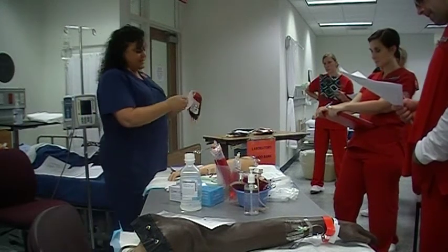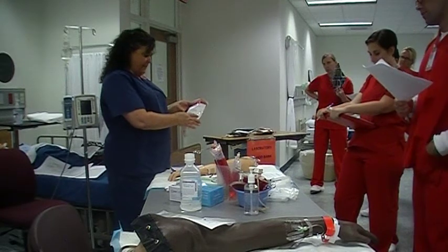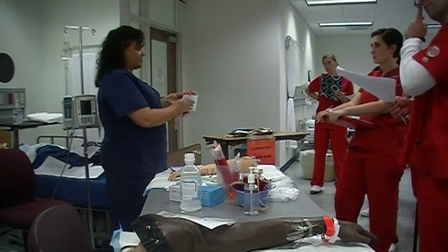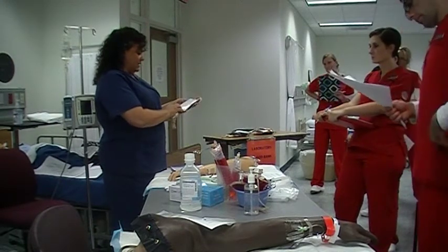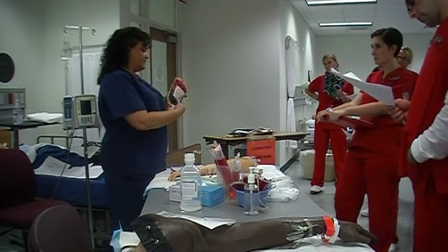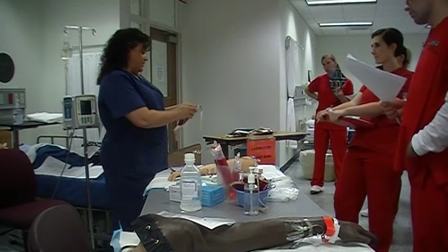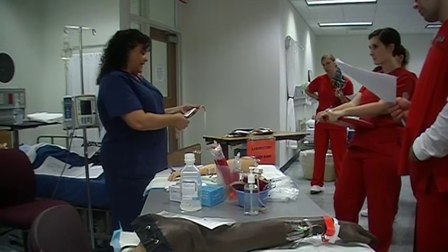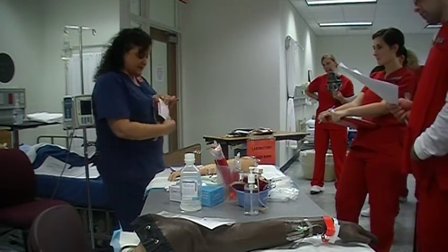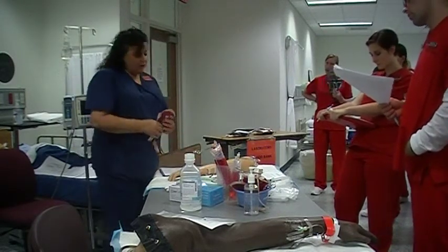So you want to make sure that the blood bank paper has their blood type, the donor unit number, and the expiration date. And those are what you're going to check next. So I'm going to look at the donor unit number, 0003944, and I'm going to look on the unit. There's a bunch of stickers with it, and it's up here. So the donor is 0003944, and it expires today. Okay, so everything matches up. You can thank Nancy Nurse, and she can go. Then you're going to put on clean gloves.